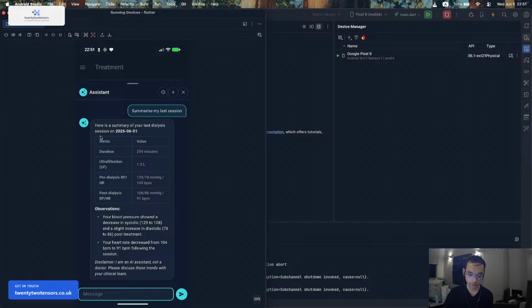It's just a way to navigate input. The AI in this part is only a tool to add information, query information, and show it, nothing else. It's the way of showing the information. I don't intend to make it a professional healthcare advisor or anything. Just a tool to help manage the daily tasks of the home hemodialysis station.